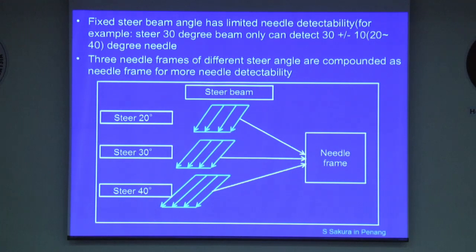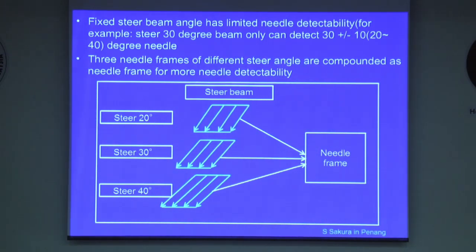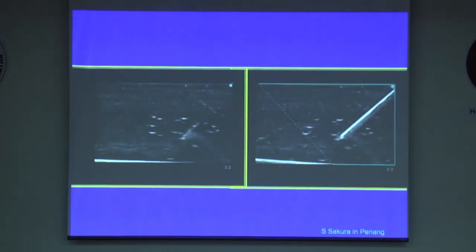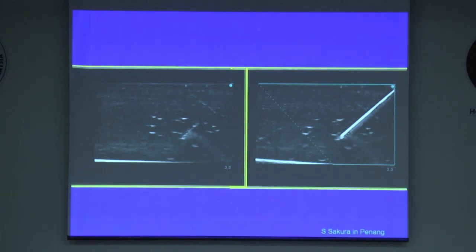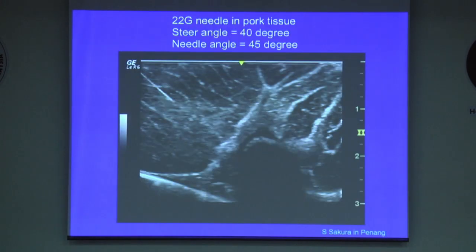In addition, some machines compound multiple frames at different steer angles to produce the best image of the needle. With normal imaging technology, you can barely see the needle inserted at a steep angle. But the same image can show the needle clearly when you turn on the needle enhancement function.